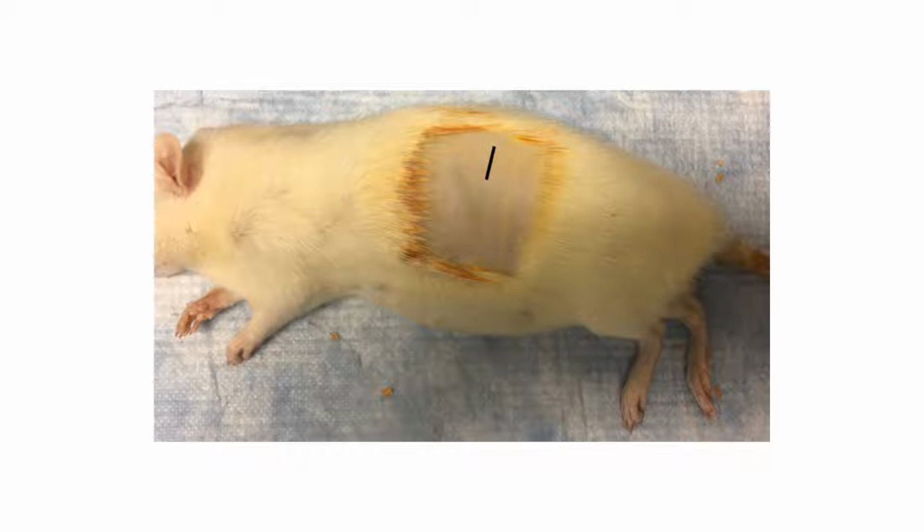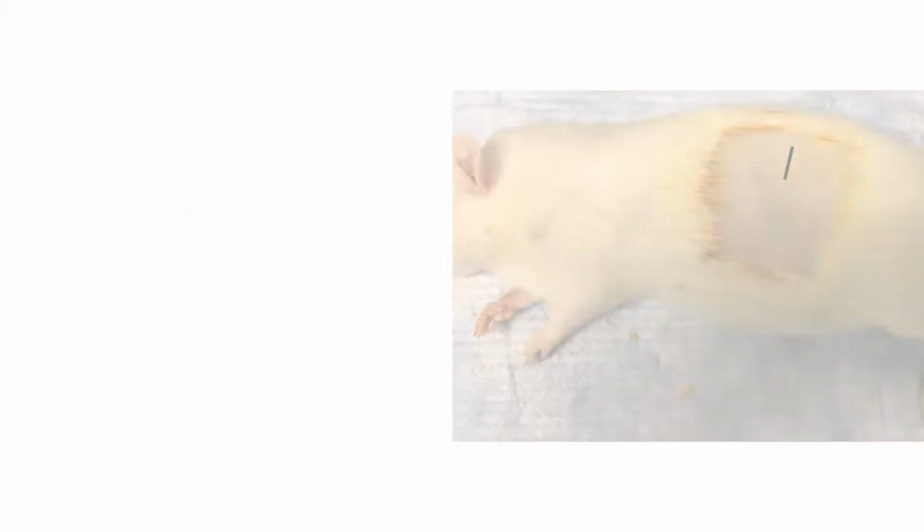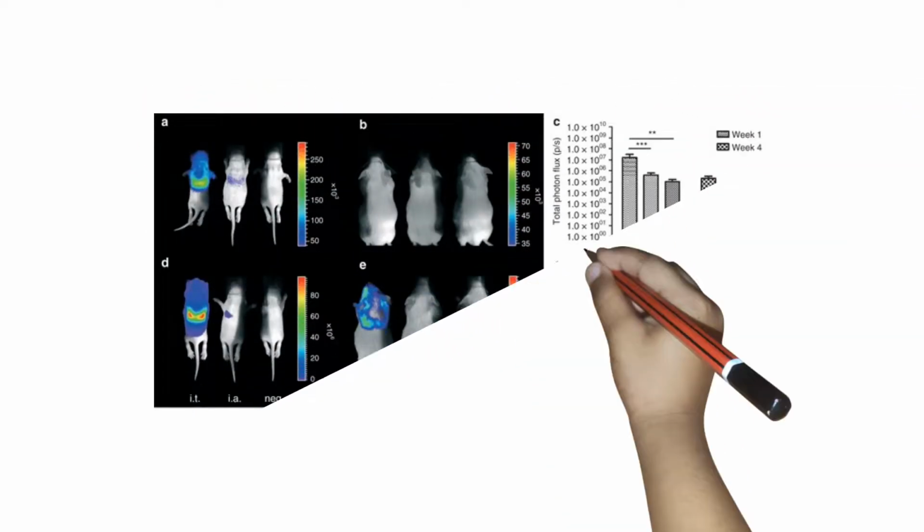Blood components are also one of the things which give red color, so for that you need to choose particular dyes. So hair removal will be done either by shaving, or you can use any epilators, or by using the depilation method. So whatever you want to do, you can perform as per your choice.